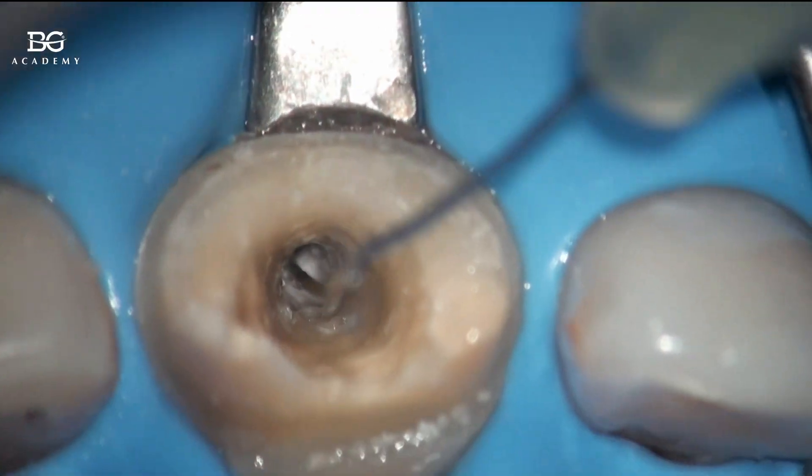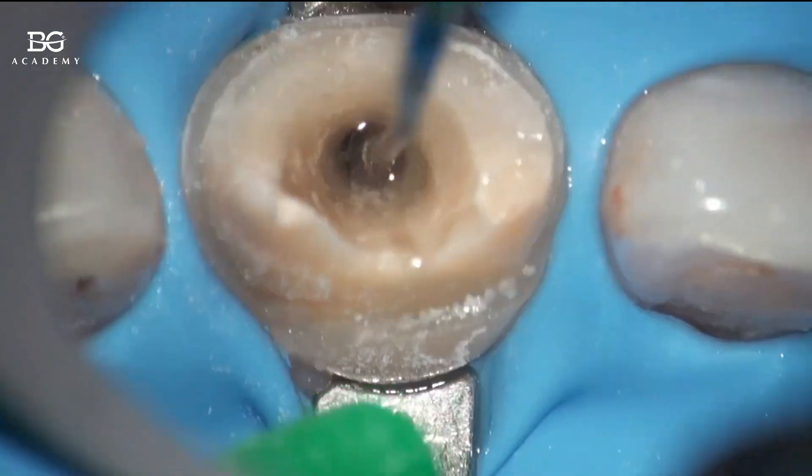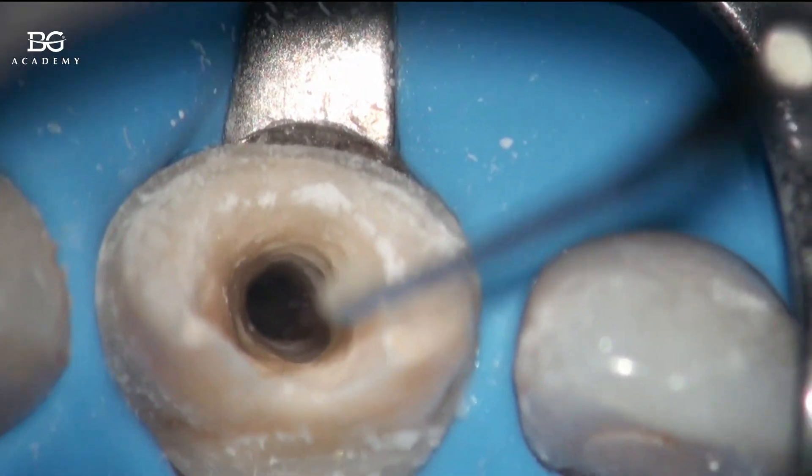You can see that I'm just rinsing the calcium hydroxide out from the root canal. We kept this tooth under the calcium hydroxide for a few weeks.